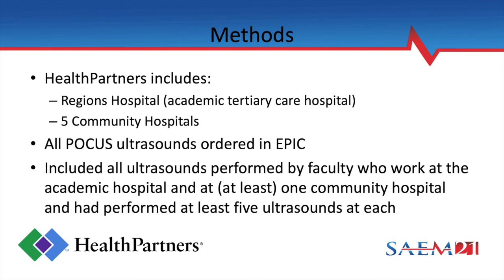In this study, I included all ultrasounds performed by faculty who work at the academic hospital and at least one community hospital. I included only those faculty that had performed at least 5 ultrasounds at each setting. This was to eliminate some of the faculty that would perform an ultrasound here and there, but not consistently.